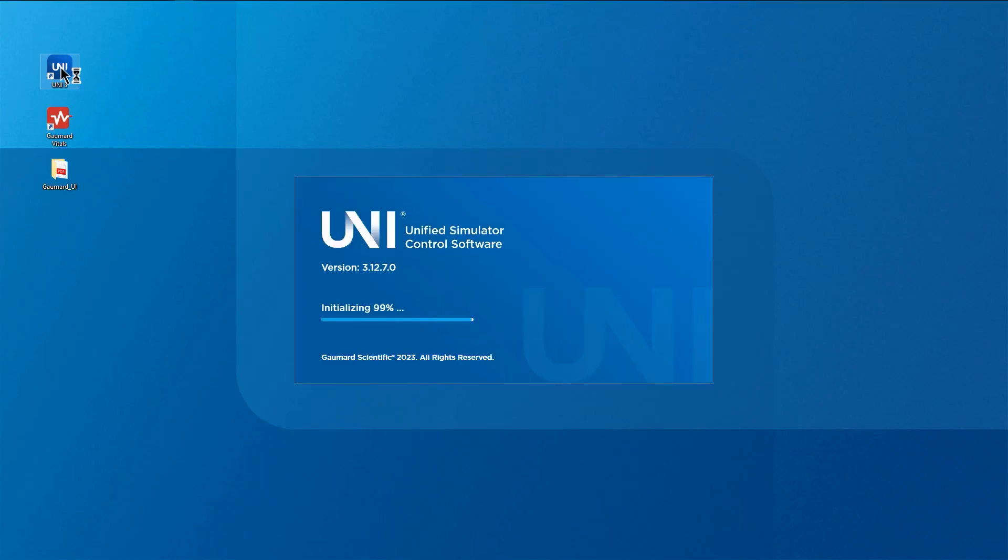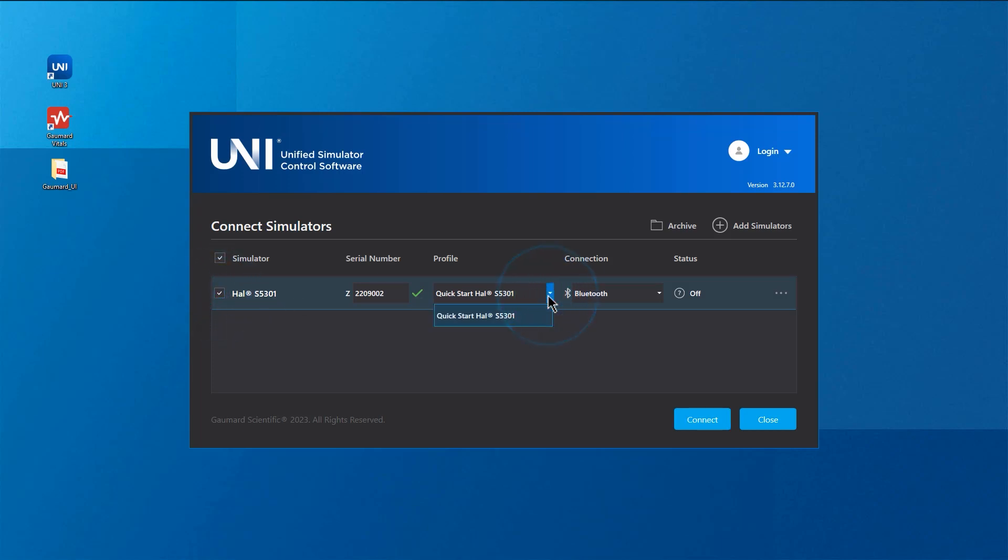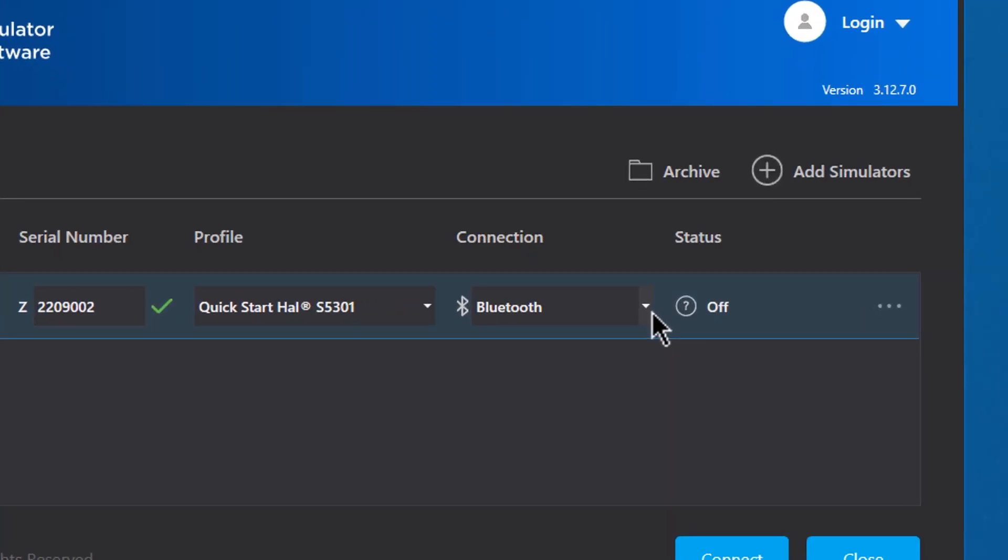Remove the GoMard RF dongle and open Uni3. On the simulator selection page, choose your desired simulator by clicking on the box next to its name. Set the connection type to Bluetooth and click Connect.